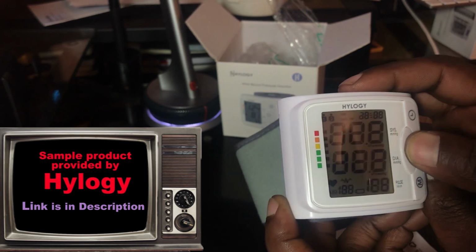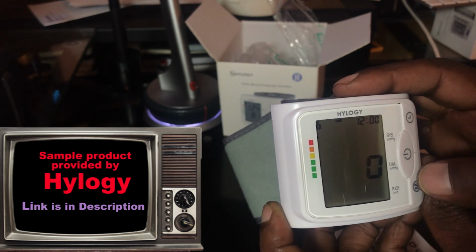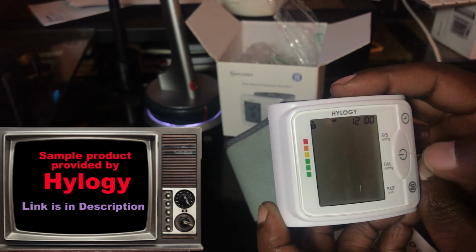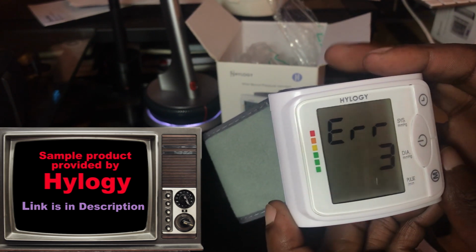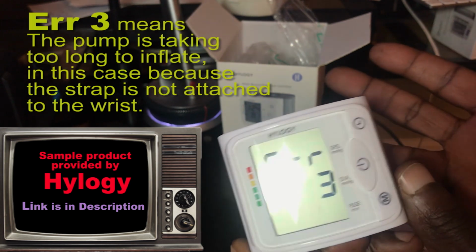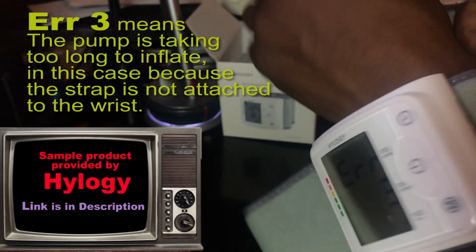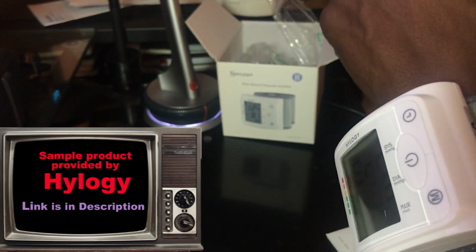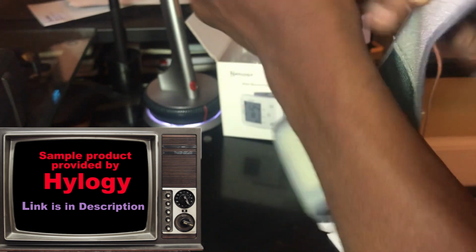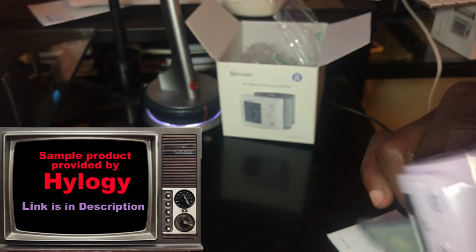So let's see. All right, so it's got DIA. It's actually going. So I don't have it on my wrist, and it's already recording an error, which I think is what it should do. So now I'm gonna put it on my wrist and see how that works. Oopsie. So that didn't work too well the first time around.